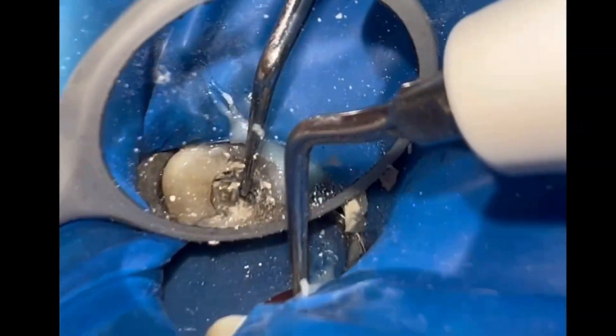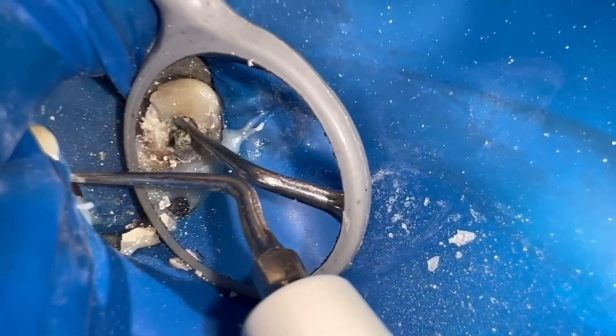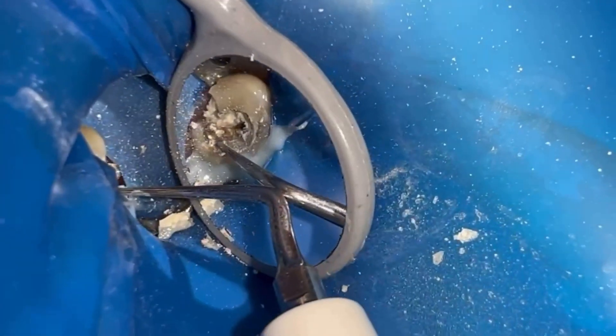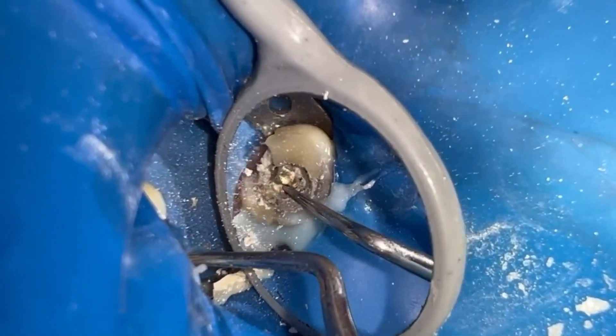Counter-clockwise movements must be made with the ultrasonic tip. To remove posts, I recommend tips like Start X 3 or 4 and Woodpecker ED-12D.